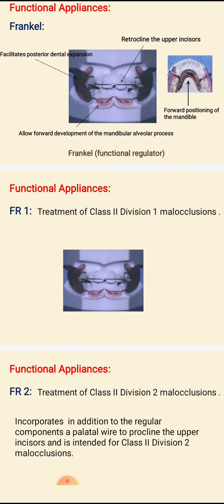So we have modifications of the Frankel appliance. Frankel appliance 1 or FR1 is used for the treatment of class 2 division 1, and it's the design that we explained in the previous slide.